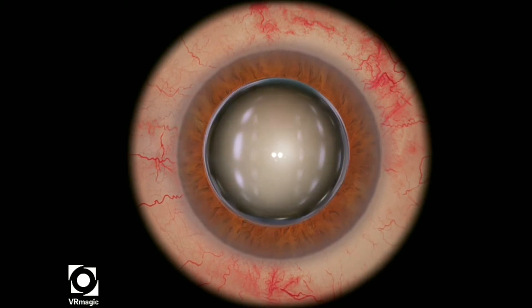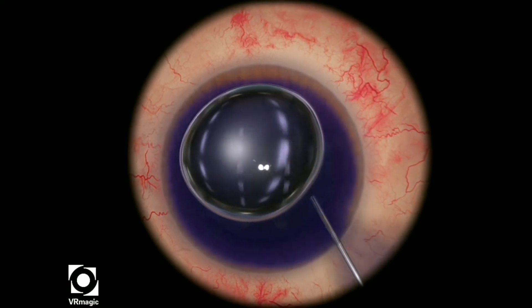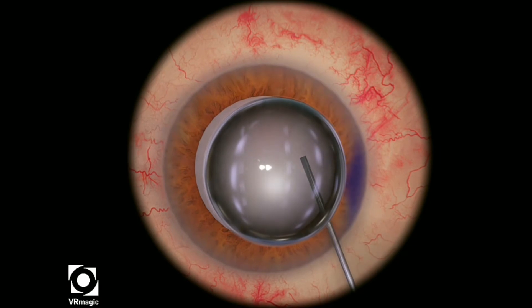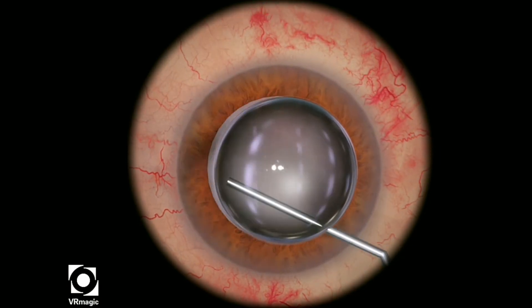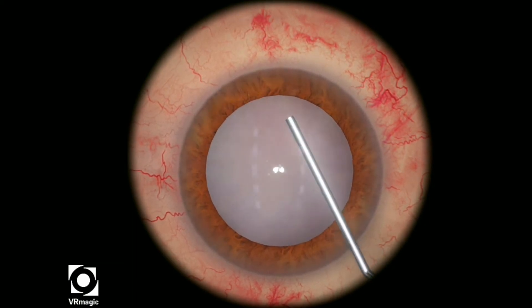This is a very, very challenging level, so it took me multiple attempts to actually get this particular video the way I wanted it to. Start off in the regular fashion with an air bubble, stain the anterior capsule with the TriPan Blue, and then use the viscoelastic in order to fill the AC.